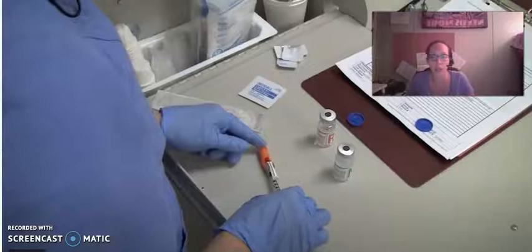Okay, now at that point, she will go into her patient's room. She will use her checks, identifiers, and rights again. Yes, I said again, lots of checks, identifiers, and rights. Make sure she's in the right room with the right patient, giving the right amount of insulin. And then she will administer the insulin in the same way as a sub-Q would be administered for any other medication.